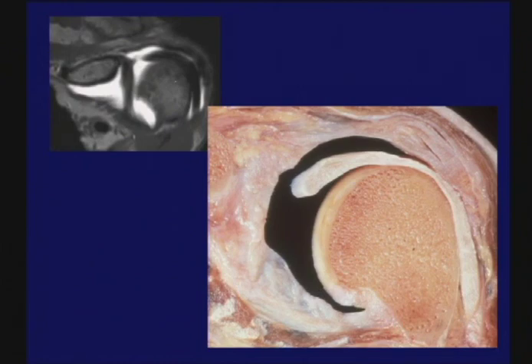We published a number of articles on it. And all my friends wrote to me and said, this will go nowhere, because we have made MR invasive. Now, I know some of you go to a lot of meetings that deal with MR, and you've probably been to some that have talked about MR arthrography and say you never need it, okay? That's an extreme view. Here we have, unfortunately, an extreme view the other way. We think we need it a lot. The truth is somewhere in between.